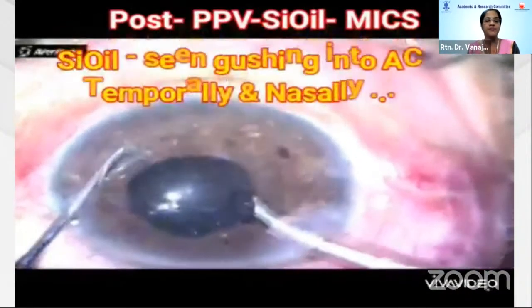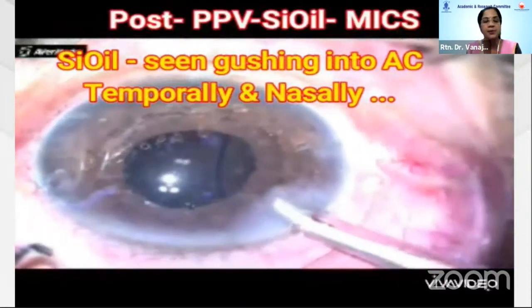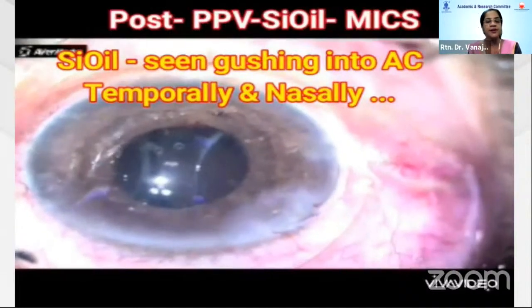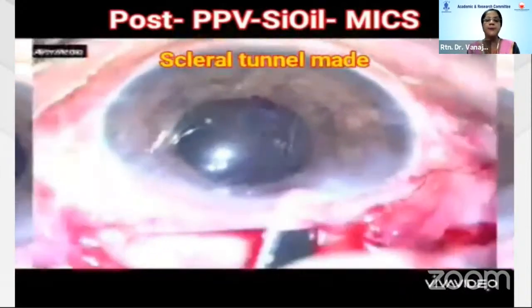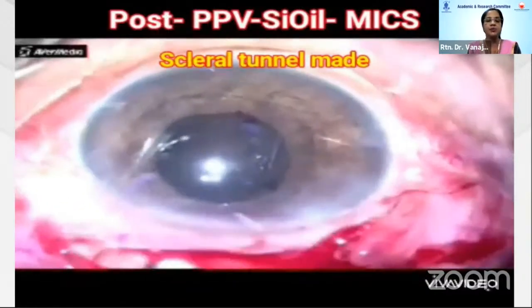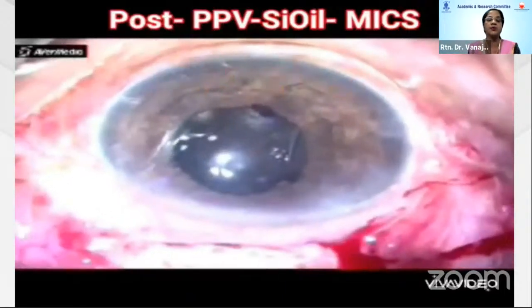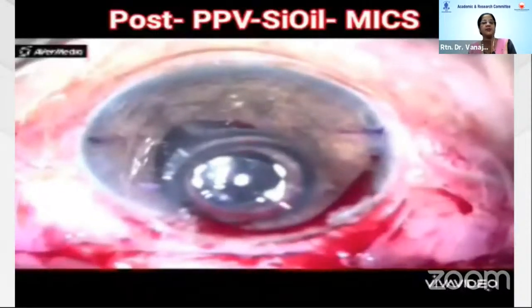As I come out, I see the silicone oil droplets coming out and the bag is rolling up already. There are both nasal and PC openings, or rather the zonules have given way. There is no nuclear material other than what I have just removed. The lens itself was a nucleus.